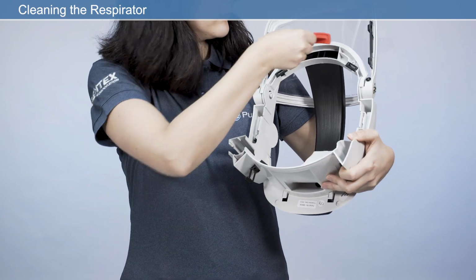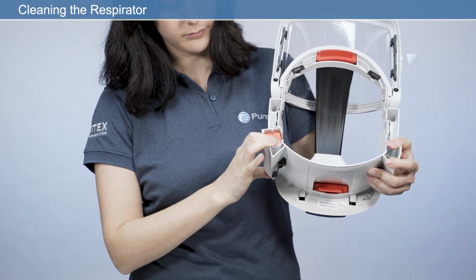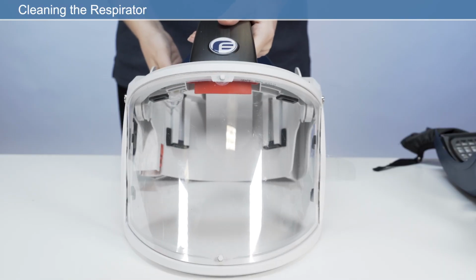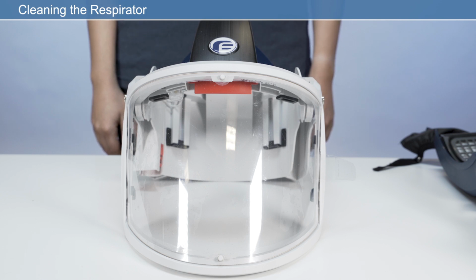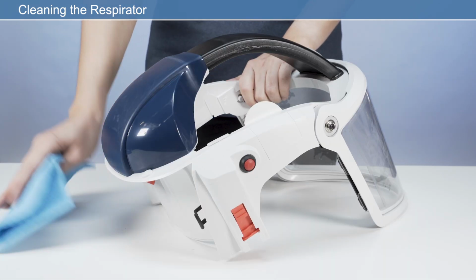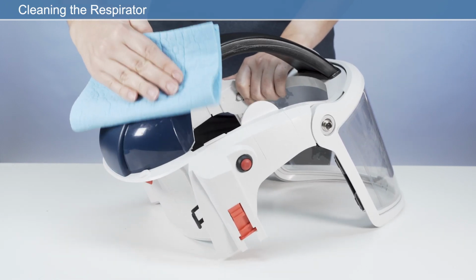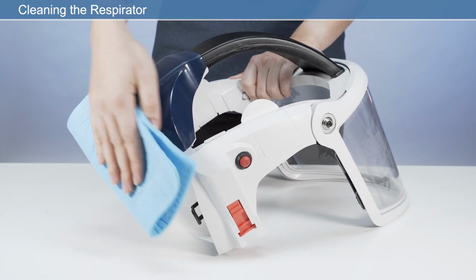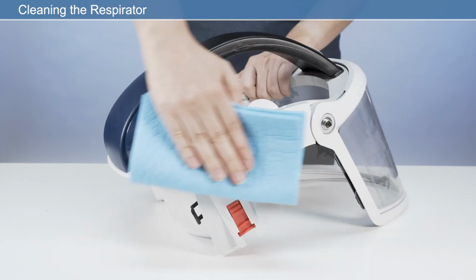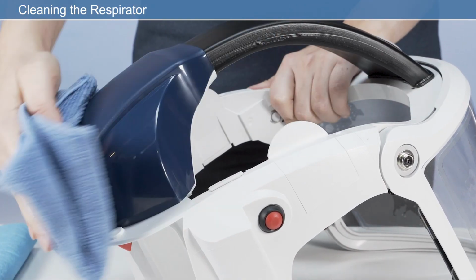Do not turn the respirator upside down or fill any area or cavity with liquids. For respirators with contamination, ensure that the face shield is down and the respirator is upright. Clean using a clean cloth with a mild solution of a household liquid soap and water. For ingrained dirt on the outside of the respirator, excluding visor, a nail brush or ultrasonic brush may be used. Dry the respirator with a clean, lint-free cloth.